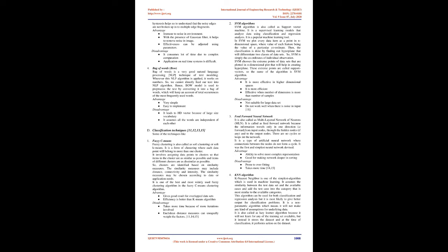Advantage. Images with same intensity, better performance, high contrast, and different gray values among object and background. Large computational efficiency and accuracy. Disadvantage. Correlation of pixels is not important, because of noise present in the image.